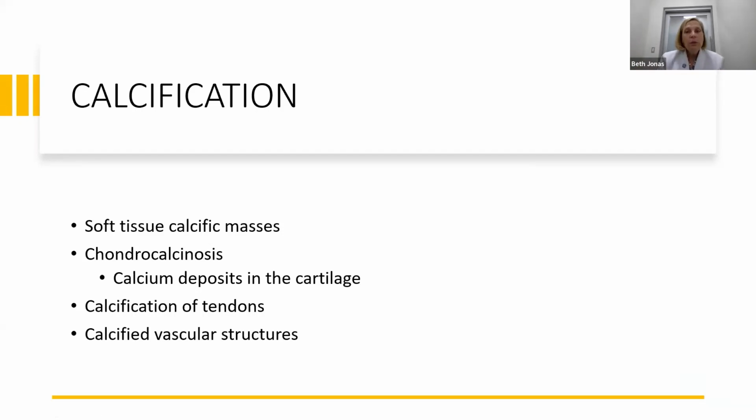So next we look at calcification. There may be calcified masses in the soft tissue, as I showed you just a few slides ago when we looked at that lumpy, bumpy soft tissue swelling with the calcification that I told you was a tophus. That's typically what happens. A lot of tophi, you can't really see them because they're not calcified, but when they become calcified, you can.